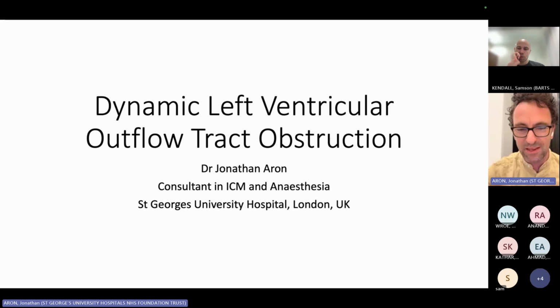And really, this is what echo is all about in critical care: in a timely fashion, spotting something that you cannot spot with clinical examination or suspicion alone. So it's a great topic to be teaching about.